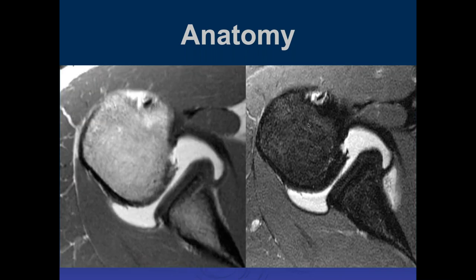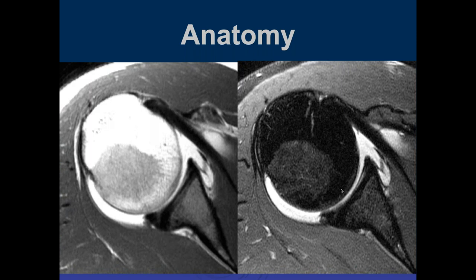In the axial plane with T1 arthrogram and PD fat sat, inferiorly we see the articular cartilage on the glenoid and humeral head. Going superiorly we see the articular cartilages, anterior and posterior labrum, and the middle glenohumeral ligament. There are basically three structures anteriorly to differentiate: the middle glenohumeral ligament, the anterior band of the inferior glenohumeral ligament (which may attach superiorly), and the anterior labrum. A labral tear could masquerade as either of the other two.